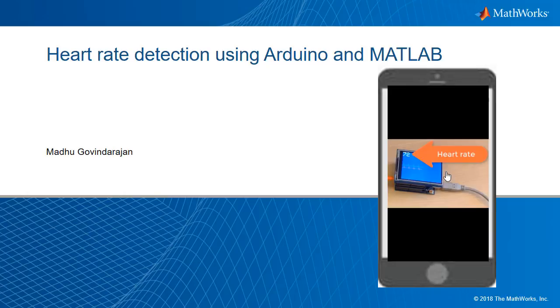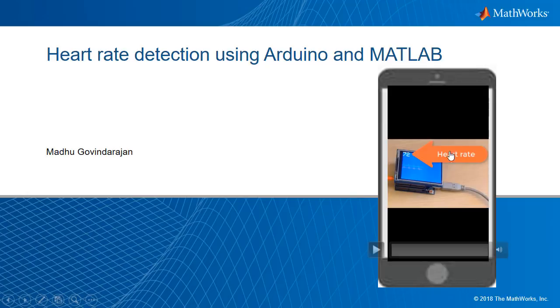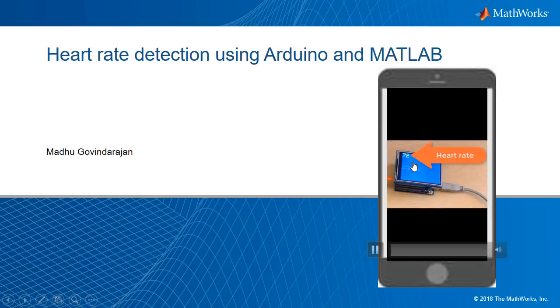Before we go into the details of this demo, I wanted to show a quick video. As you can see on the little screen here, the heart rate is displayed on the top left corner and the actual ECG signal and the filtered signal are displayed right in the middle of the screen here.